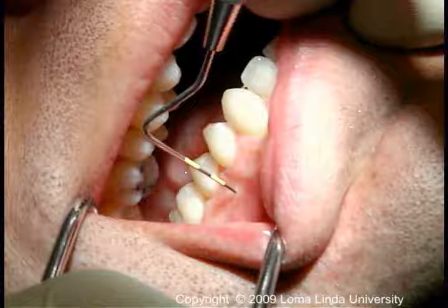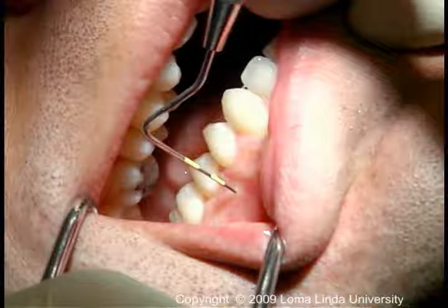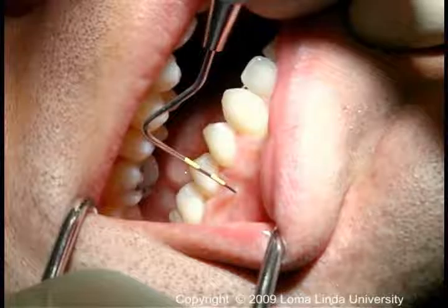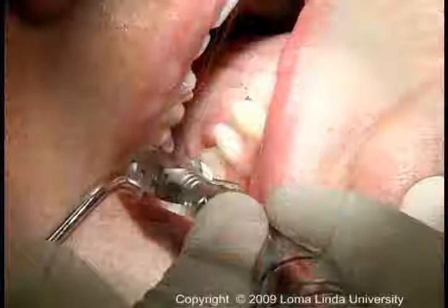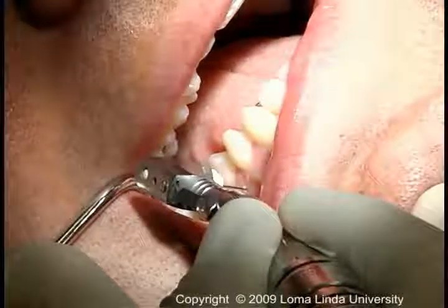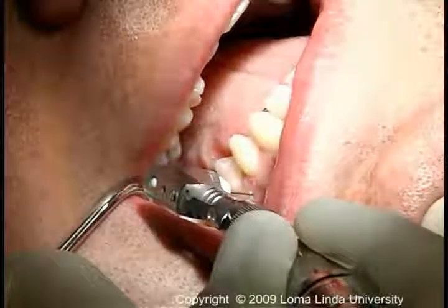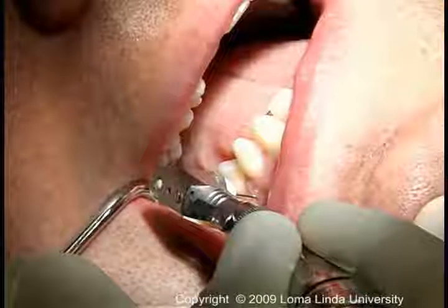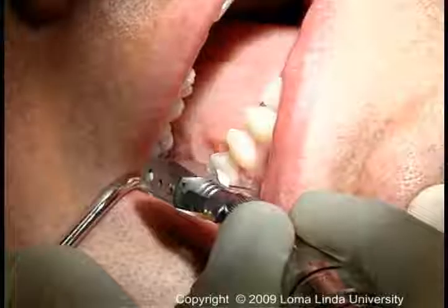This shows the location of penetration, which is in the interradicular space with the attached gingiva slightly apical to the cervical margins of the crowns. The perforator, or number 2 round burr, is positioned and advanced slowly. Use alternating pressure or a type of pecking action.